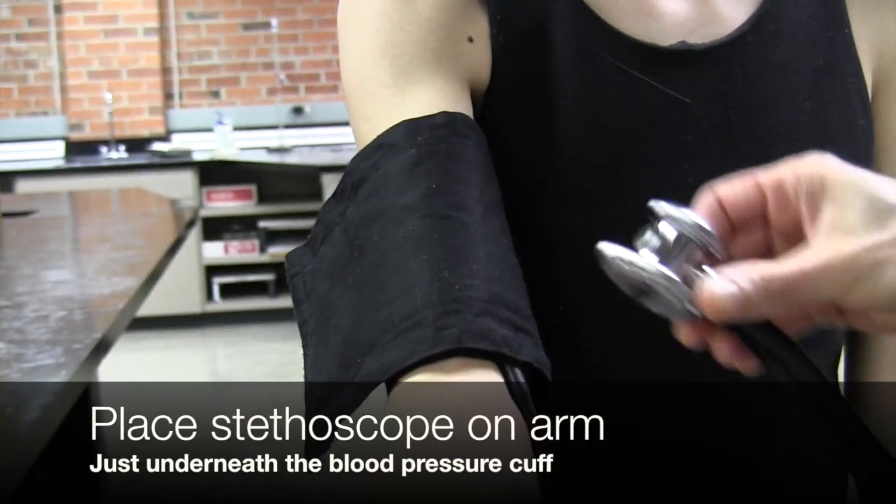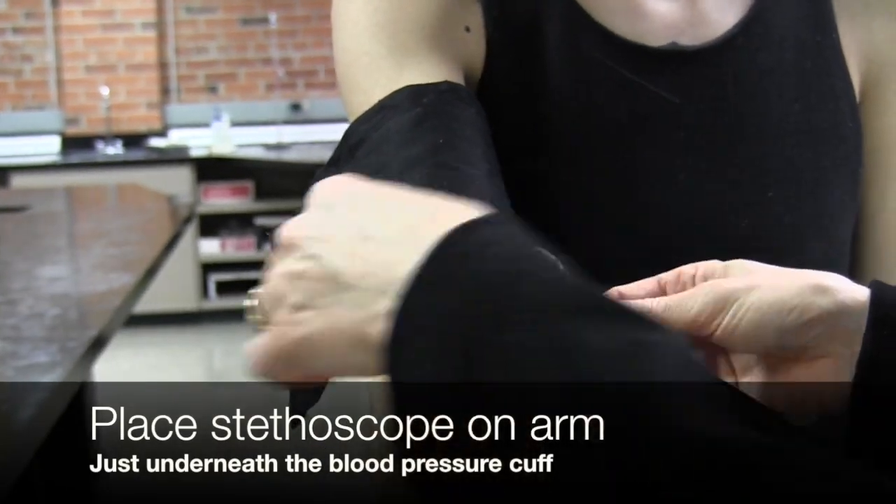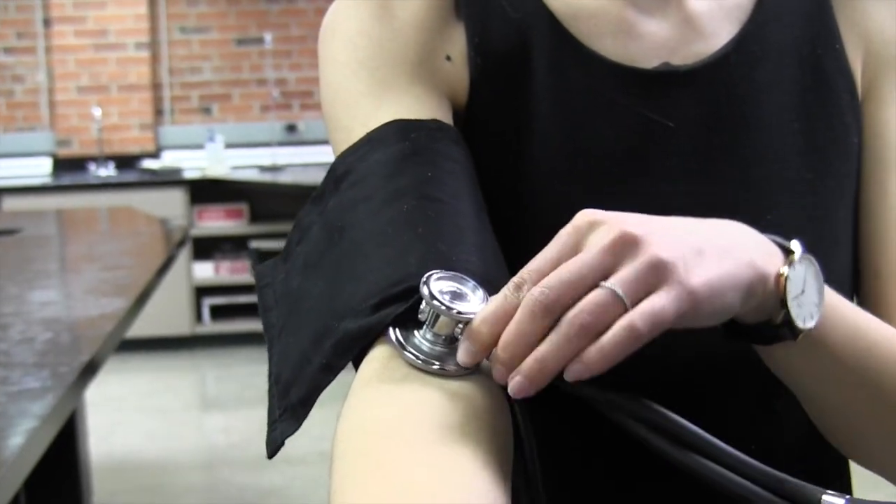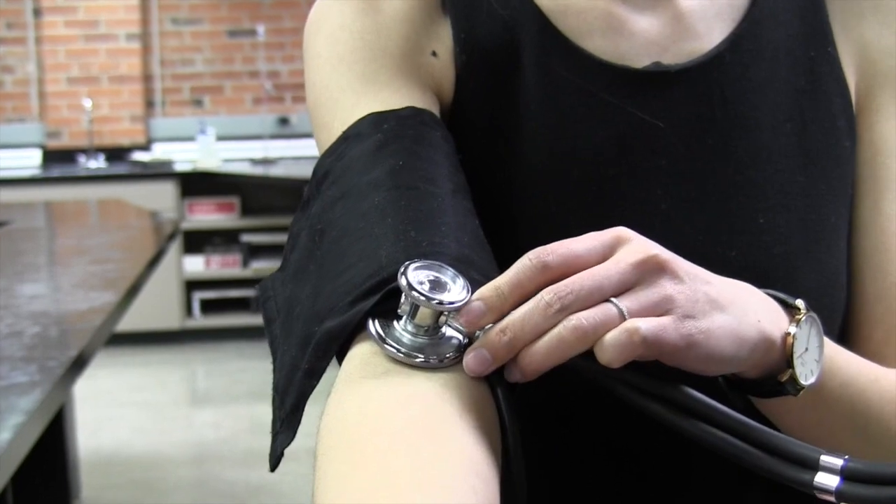Next we'll place our stethoscope just underneath the blood pressure cuff at the elbow so we can listen for sounds of the heartbeat when we pump it up.